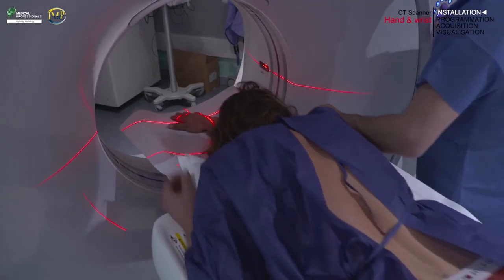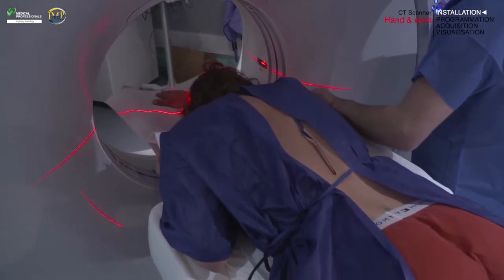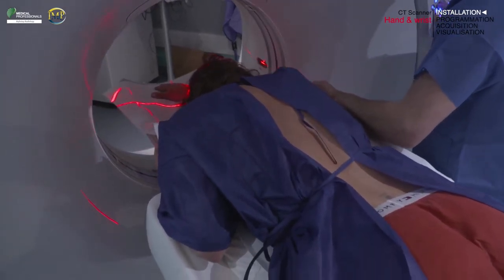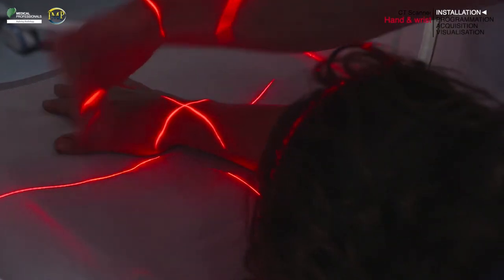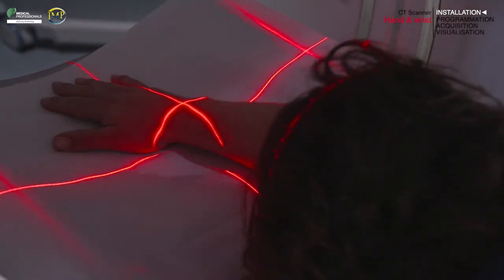Place your central ray using the system laser light at the level of the radial and ulnar styloid process axes at a midpoint of the wrist joint. Verify the lateral laser light is at the mid-coronal plane of the wrist and the longitudinal laser light is midway between the lateral borders of the wrist.